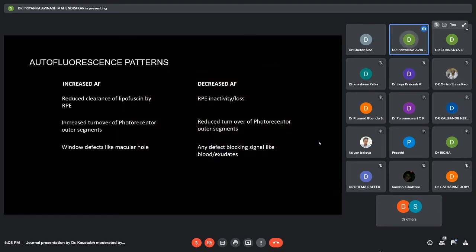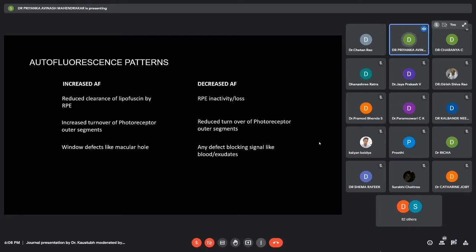Now, we will see patterns in retinal detachment, autofluorescence patterns in retinal detachment pre and post repair and try to understand the pathophysiology behind them.